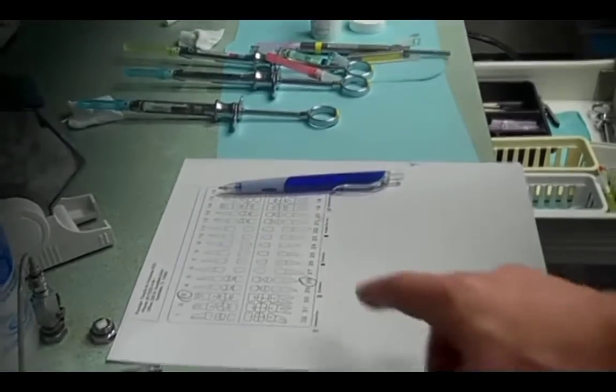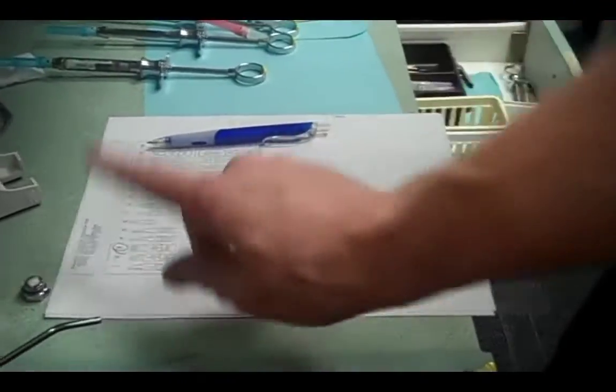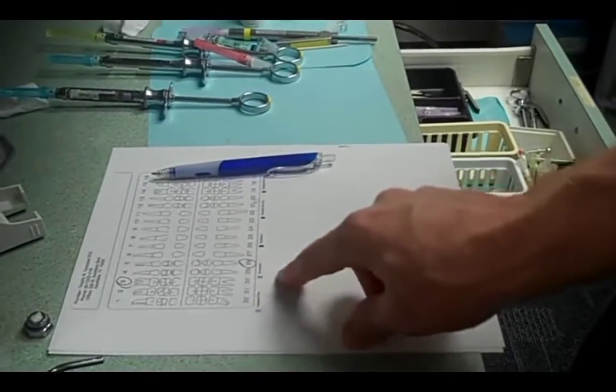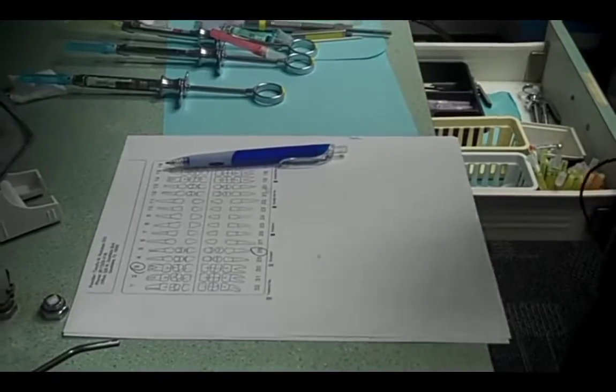Okay. So the answer here is we would infiltrate with 30 gauge and Septo here and infiltrate with 30 and Septo here. Okay? All right. All right, April, come here. Now it's your turn. Another quiz.